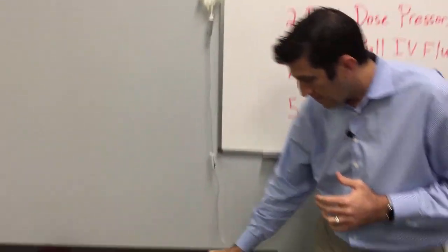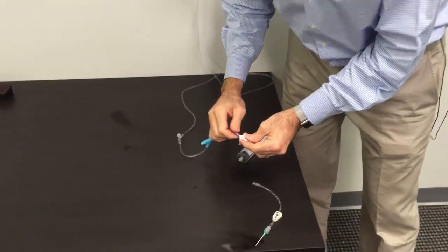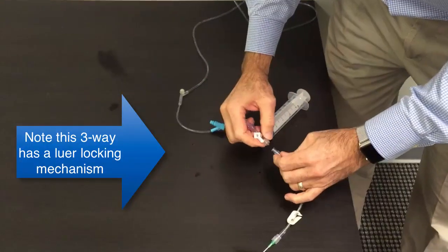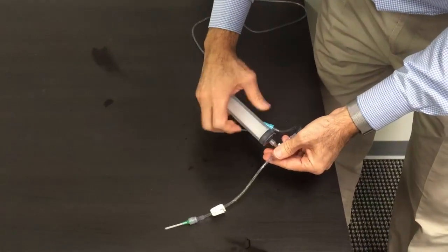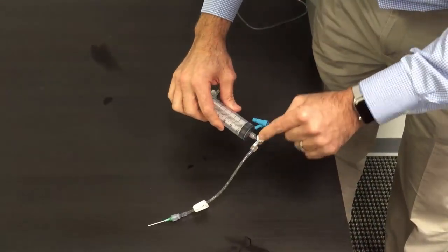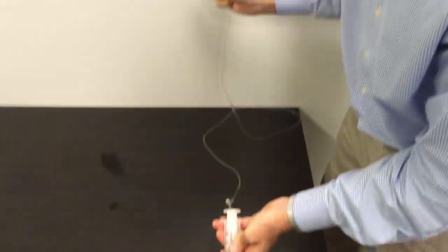First we have our IV bag, our IV tubing, and here's our three-way stopcock. So we're going to go ahead and attach it to here, we're going to attach this to the patient, and then we're going to attach our 60 cc luer lock syringe, and now we're going to be off to the patient. You can see here by opening up the IV bag, we can pull right into the 60 cc syringe.